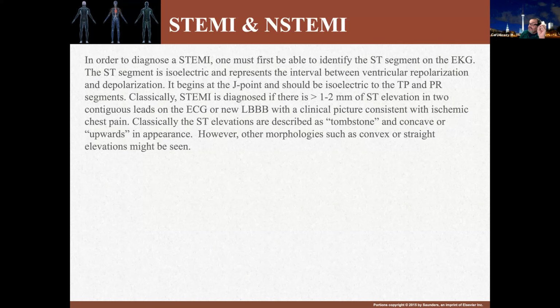Classically, you have a STEMI, an ST elevated myocardial infarction, if you have about 1 to 2 millimeters of ST elevation in 2 contiguous leads, or a new left bundle branch block. Now, we always, or at least classically, we call these ST elevations tombstones.